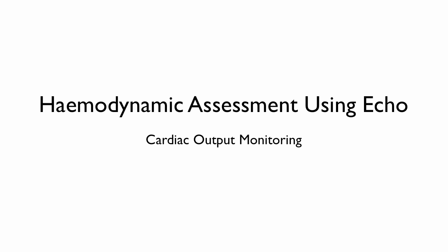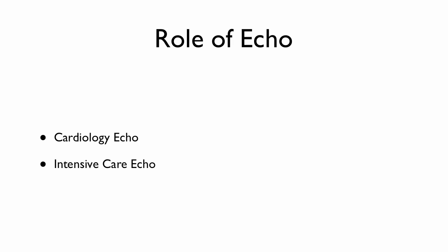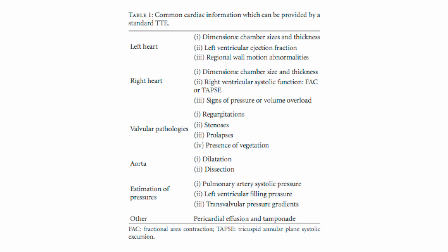This is a short talk looking at one aspect of the use of echo in intensive care, and that's for measuring cardiac output. There's several different roles of echo, and the focus is different between cardiologists and intensivists in terms of the questions that they're trying to answer when they perform echo.